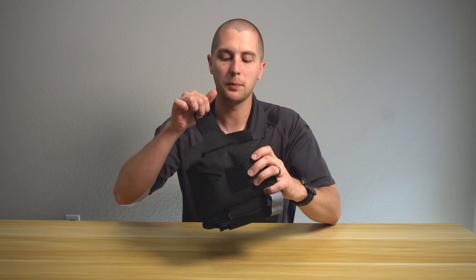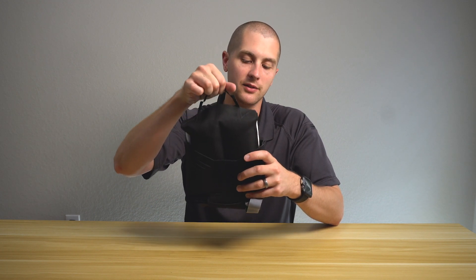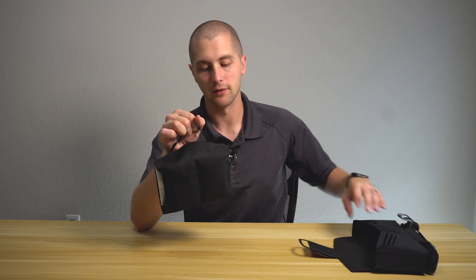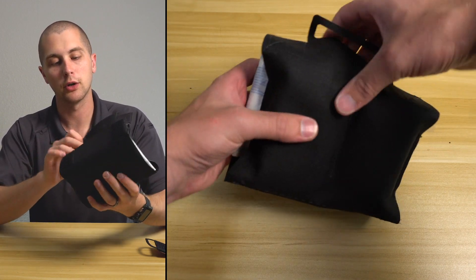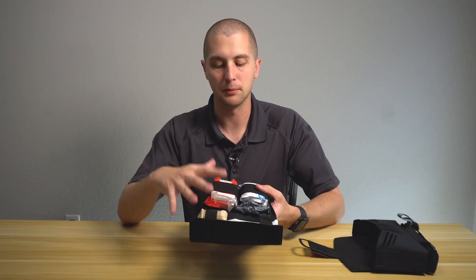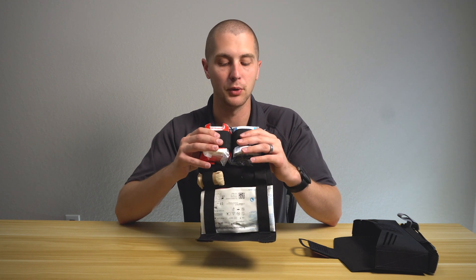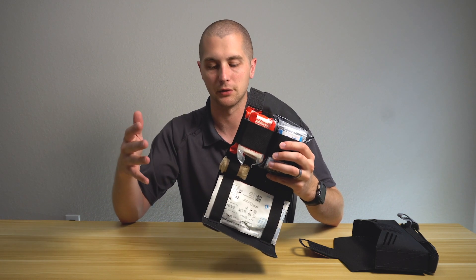Coming into the kit itself, you open this up and then you have another handle right here that you can pull to take the main contents of the kit out of the bag. So this will remain on your belt or plate carrier and allow you to access your medical equipment and get it in front of you. Once open, it has two hook-and-loop closures and folds out. What I really like about this kit is how simple it is — it doesn't feel like the supplies are jam-packed, and it's very purpose-built. It does come with some supplies not commonly found in a bleeder kit, which I really enjoy.